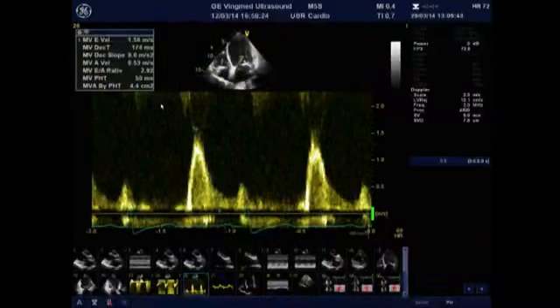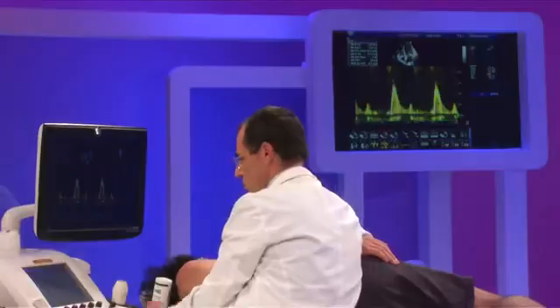Also in the four-chamber view, we can assess the transmitral inflow profile. As we know, in patients with depressed LV function, the transmitral inflow profile has reasonable correlations with invasively measured LV filling pressures. This patient has an E wave higher than an A wave, pointing to a pseudo-normalization pattern and pointing to increased LV filling pressures. His E to A ratio is high, but the deceleration time is higher than 150 milliseconds, so it is not yet a restrictive pattern.